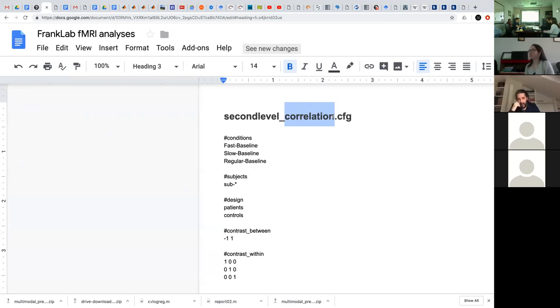I don't know. Again, what do you think? Do you think it's better to keep one configuration file for multiple types of conditions, having all of them in a single folder, and just allow multiple conditions at the second level on that?